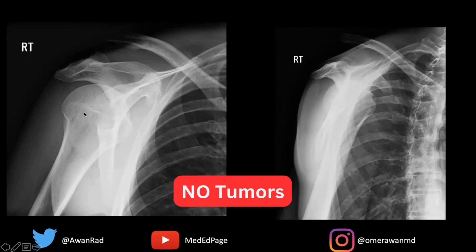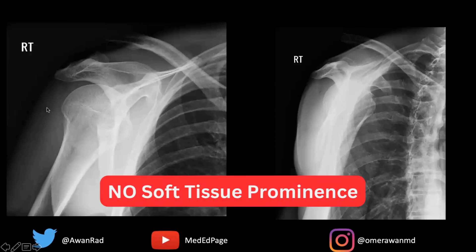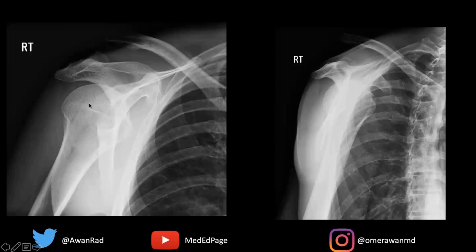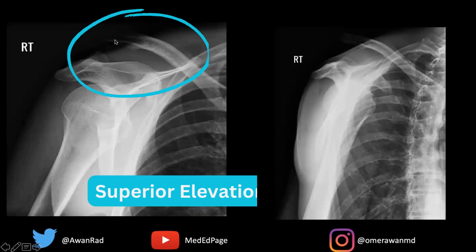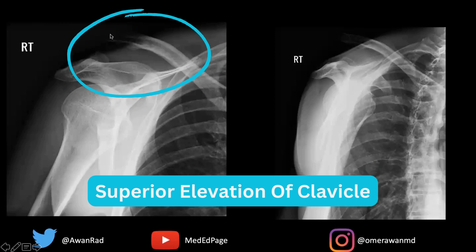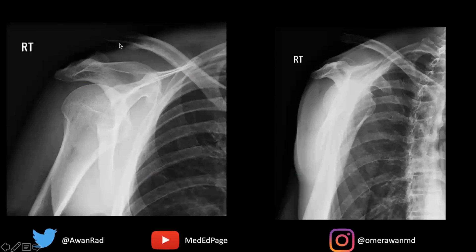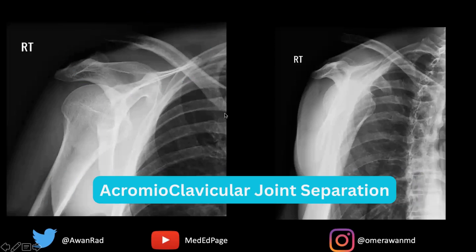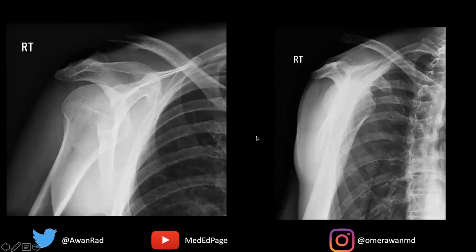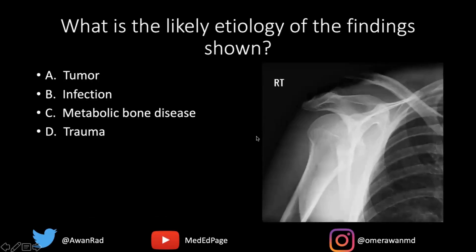I don't see any tumors. There's no soft tissue swelling or prominence here. The lung looks good. However, if we take a look — and this can be easily missed if you're going very fast, if you're reading the ED, you're used to reading hundreds of cases — notice that there is superior elevation of this clavicle. This clavicle is not articulating well with the acromion process of the scapula. Although there's no fracture, this indicates that there is, in fact, an acromioclavicular joint separation or dislocation.